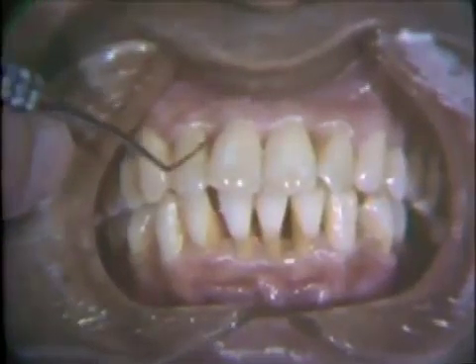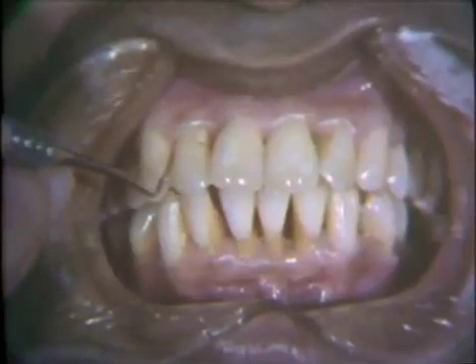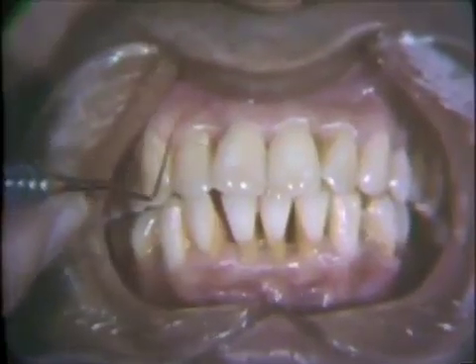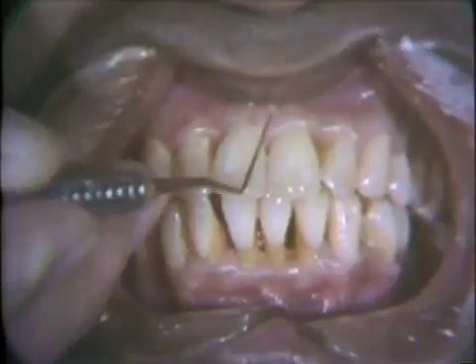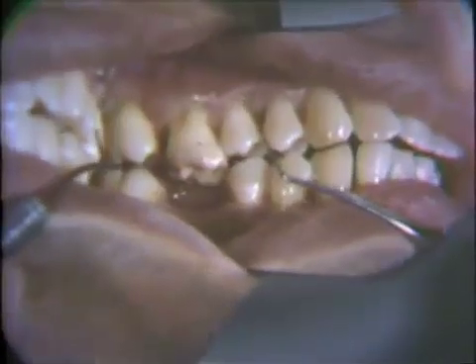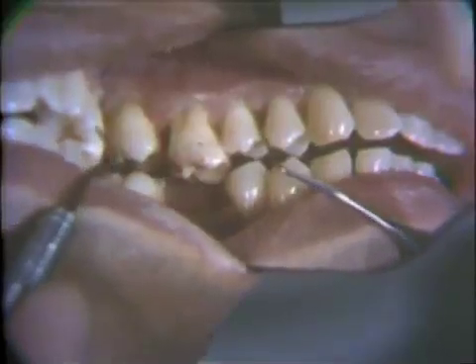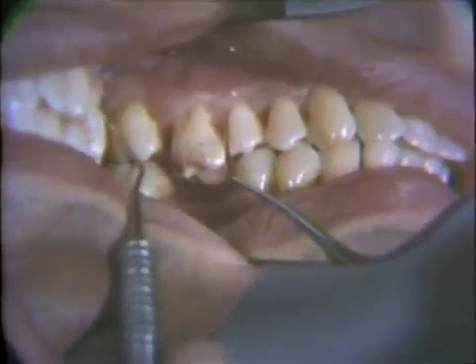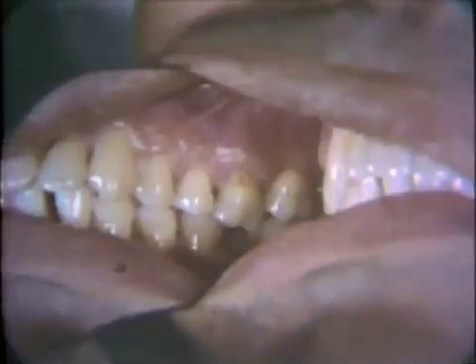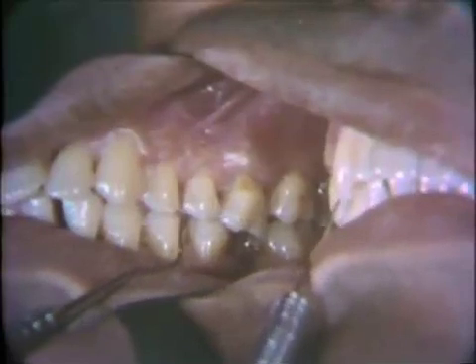When the patient is recalled following the completion of the scaling, root planing, polishing, and instruction in oral hygiene, his gingival tissues are reexamined. Note that there is no gingival bleeding from probing and the gingival tissues have become much more firm and dense. This improvement applies both to the free and attached gingiva. Note the gingival recession and improvement in gingival form. However, there are still residual pockets in the bicuspid and molar areas. Note the firmness and good contour of the gingival tissues in the right bicuspid region.